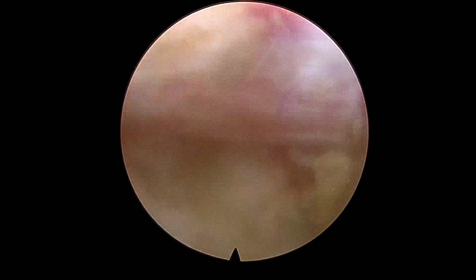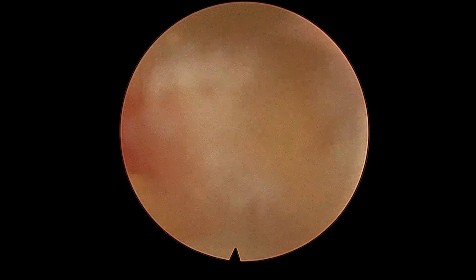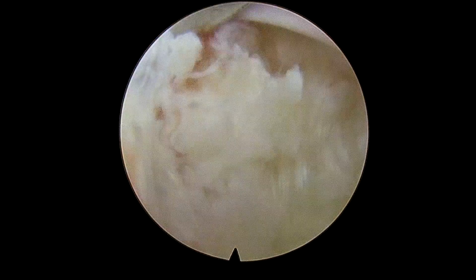Sometimes this happens when a huge bleeder opens up and it hampers your vision. There are a few techniques to identify the bleeder. What I'm doing right now is focusing my camera as close to the bleeder as possible. So take the lens of the camera closer to the bleeder and then you can identify it. We have stopped the bleeding.